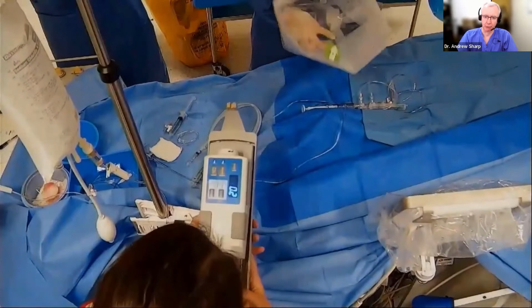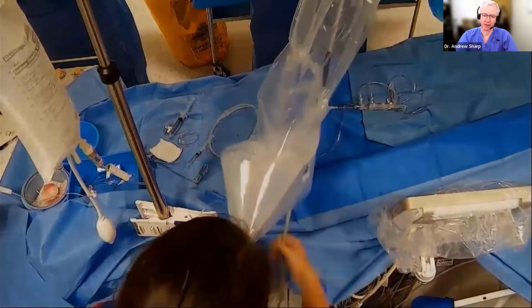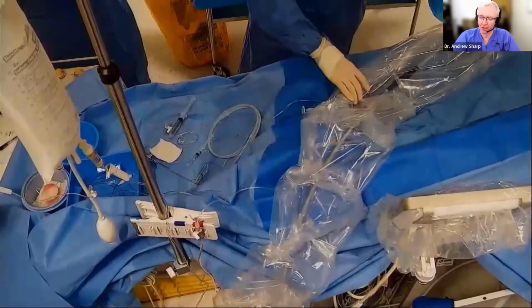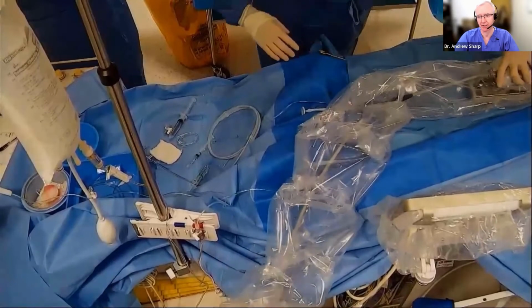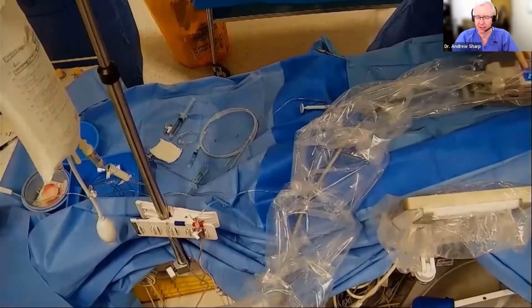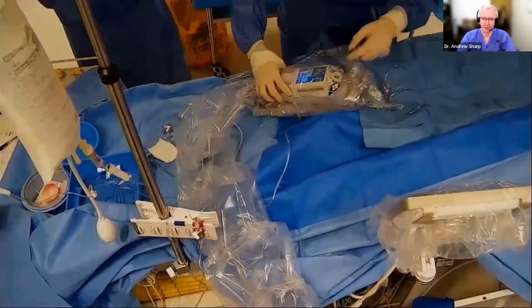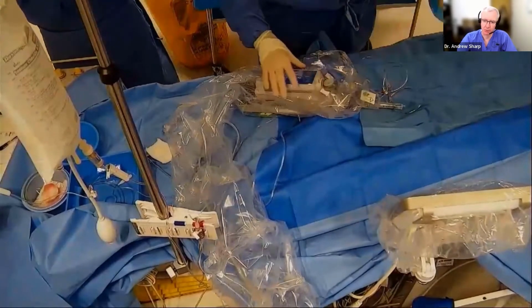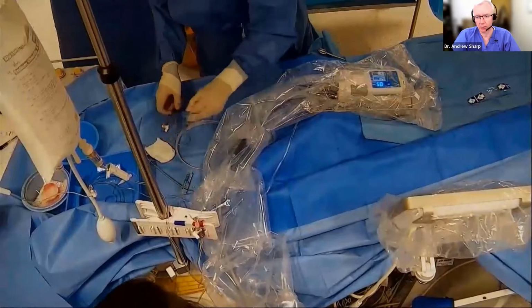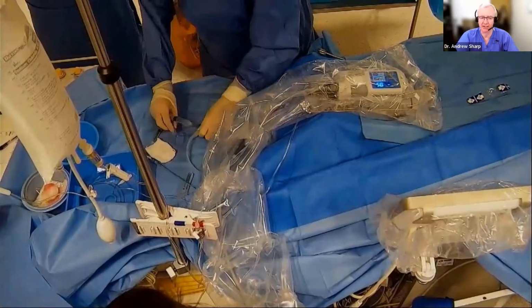So this is me receiving the device into the sterile sleeve, and we want the sterile sleeve to run as far back as we can, as long a length of sterile sleeve over the hub of the rotational IVUS device to make sure that we can move this device up and down the table without desterilizing it. We then start getting the hub of the device in shape. So we take off the sticky thing that overlies the hole. We put the hole of the device where we're going to put the IVUS back into the motorized sled.